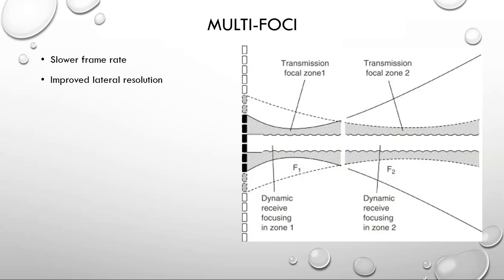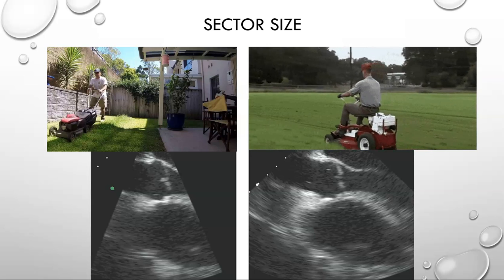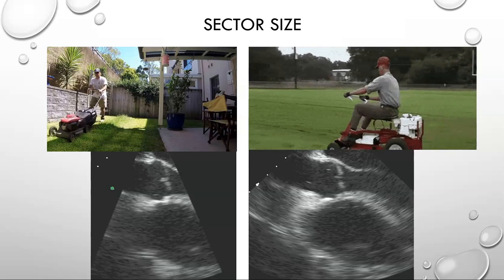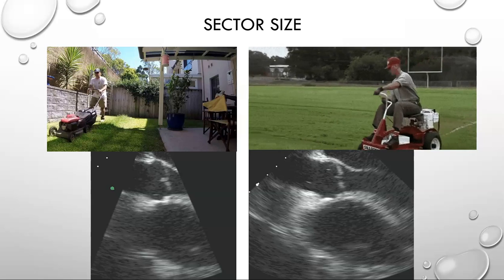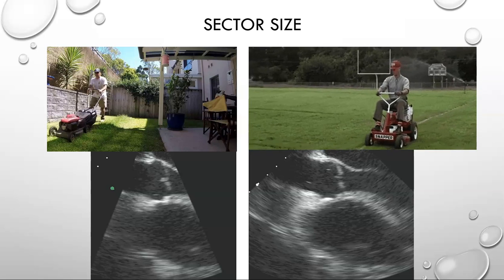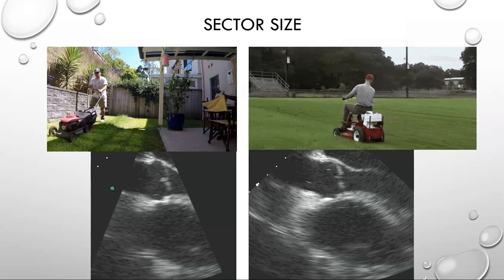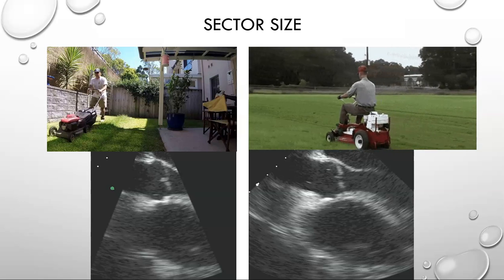And along with line density, another factor in frame time is the size of the image. And of course, a small sector size can be scanned much quicker than a large sector size. And so we have the analogy of a large football field takes longer to mow than a short little backyard, though the guy lets the grass grow much longer in his little backyard. So the bigger the sector size, of course, the slower the frame rate.